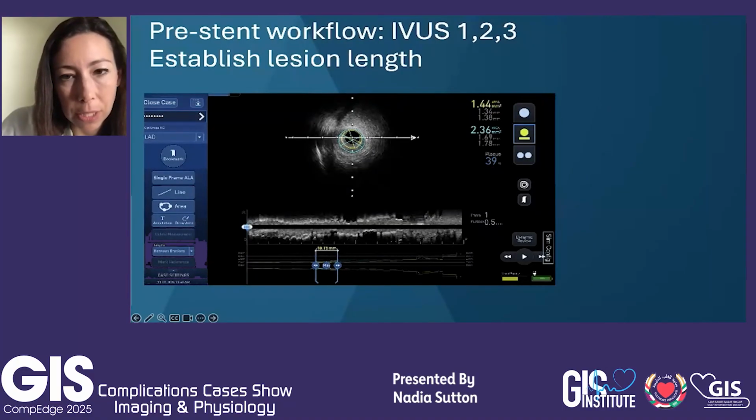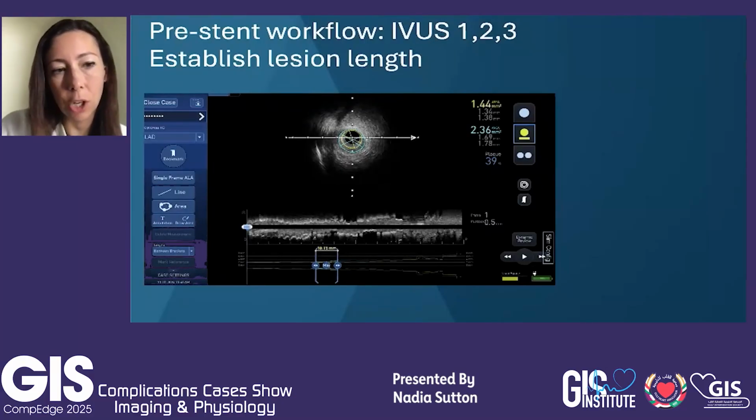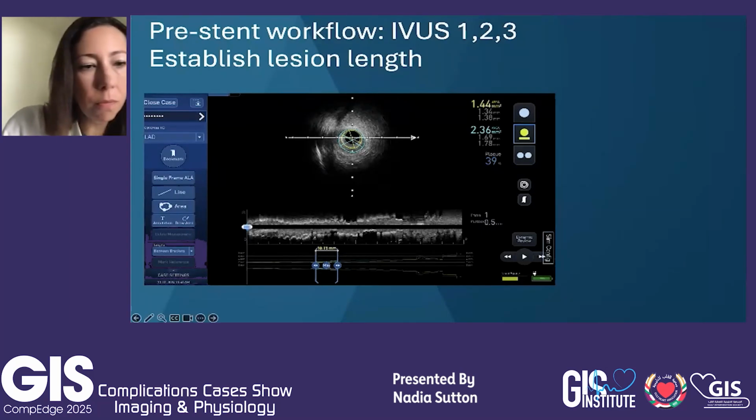That's supposed to be representative of the vessel area. Although, depending on where you select, you do have to look at it and use your own human interpretation to determine if that's representative of the surrounding areas, if that should be your reference area, or if you want to pull your edges one way or another.